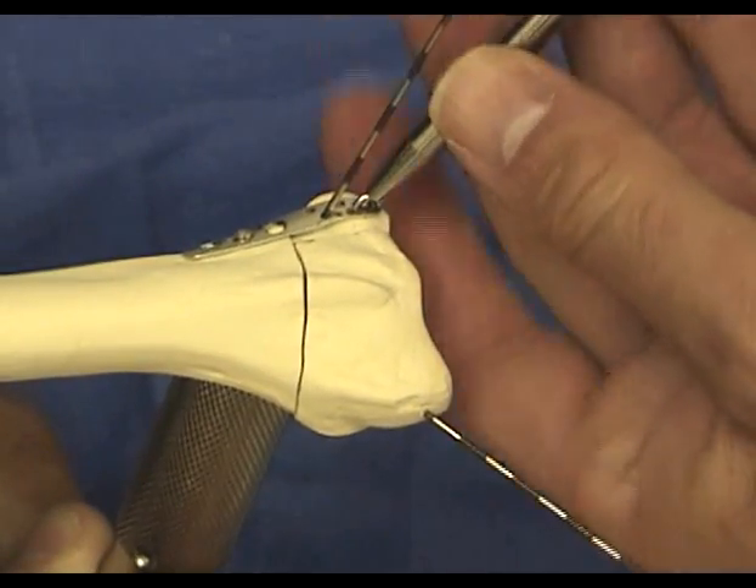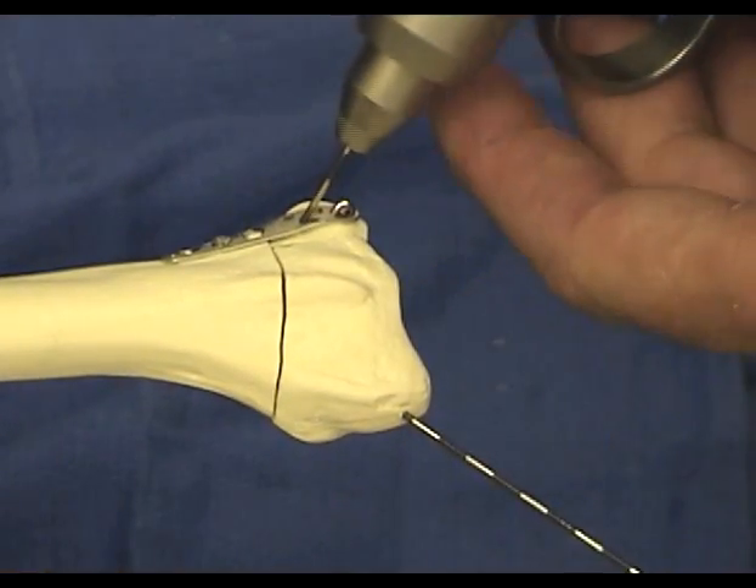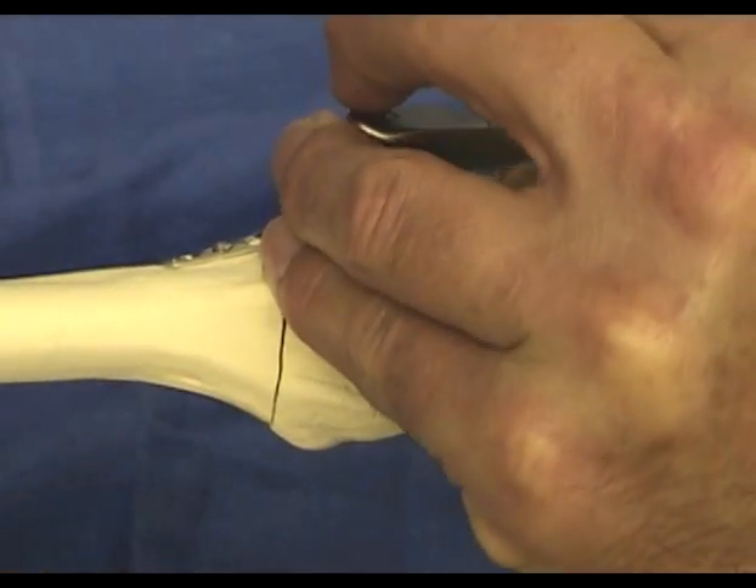The pin impactor is rotated 90 degrees to complete final seating of the hook into the plate. The same process is then repeated for the second pin.